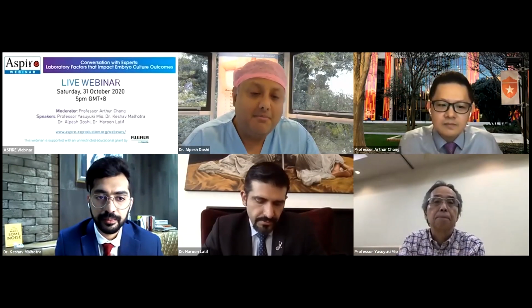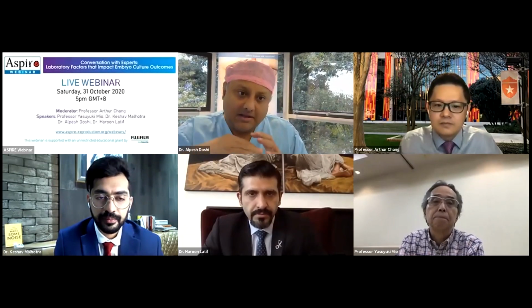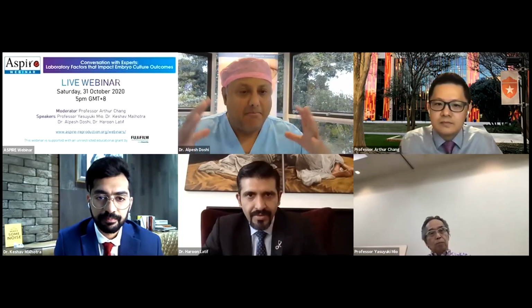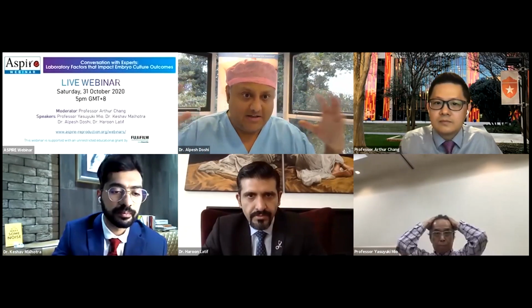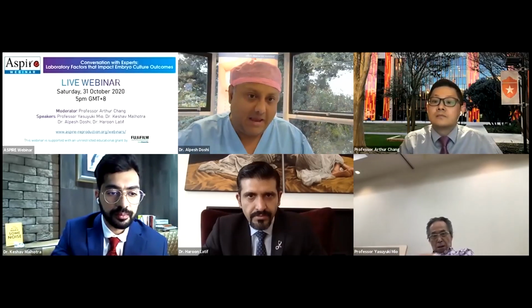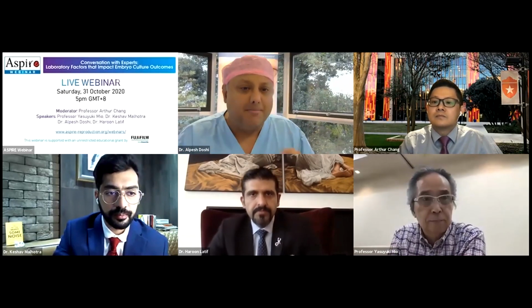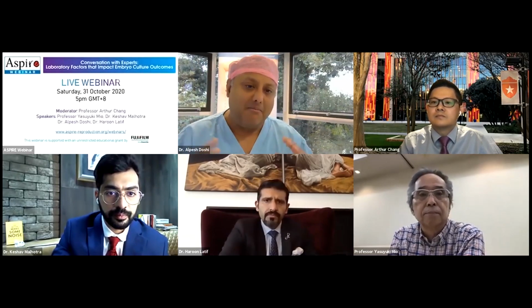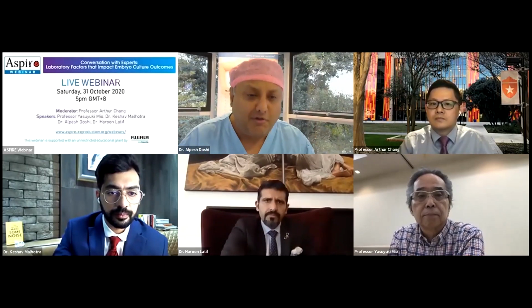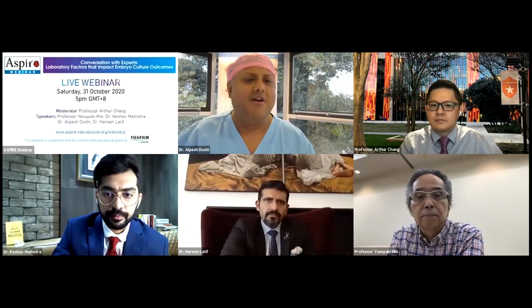Like you, Arthur, I prefer making the opening on day 3. And my reason for that is that when an embryo is under the pressure from the zona pellucida, then the trophectoderm becomes very tight and cohesive. But when there is an opportunity for the embryo to start herniating out through a breach in the zona pellucida, the biopsy becomes much easier. I feel that when I'm actually cutting cells from an embryo which has got an opening made on day 3, then it's like passing a knife through butter, whereby literally the cells come off very easily.